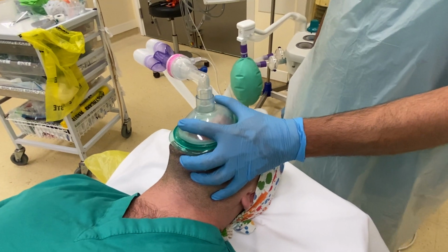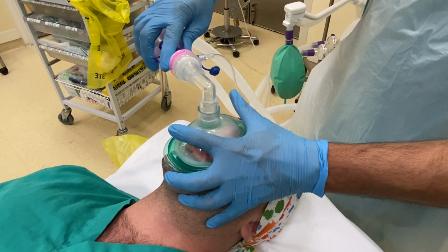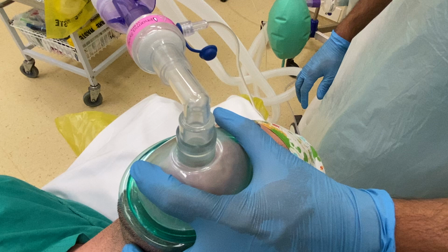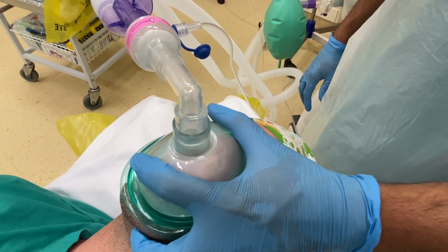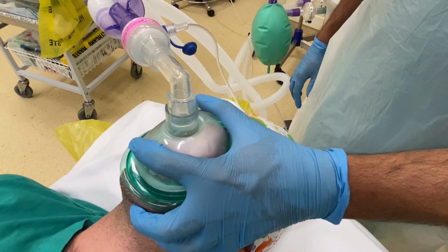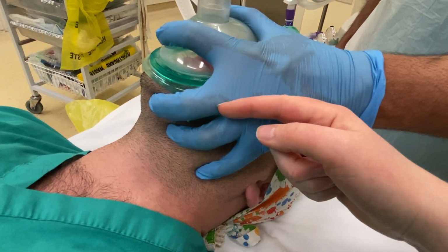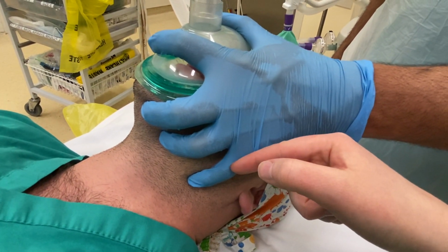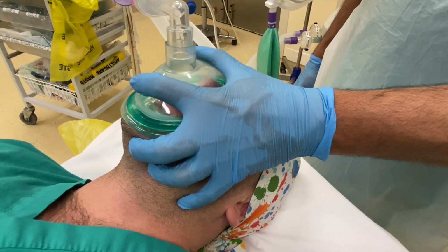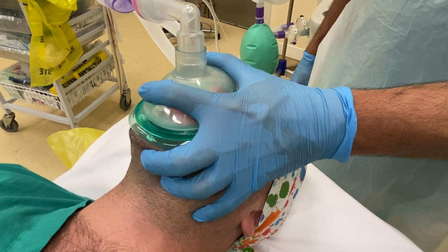When a patient is asleep, we can do the full CE grip. So this is Kumar doing the CE grip. So he has a C made with his thumb and index finger, and he's going to put downward pressure with the C. He's not going to press too hard because Irla isn't asleep, but you can press down quite firmly, so that's the mask down onto the face. Using the other 3 fingers on his hand, he is going to do mandible, mandible, angle of the jaw. So this is your E, these 3 fingers here. And what he does is he lifts the mandible up into the mask using the E. So that's down with the C, up with the E.